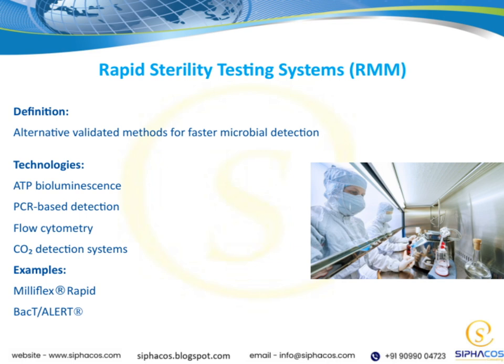As examples, systems like Milliflex Rapid and BACT/Alert are widely used in the industry. These tools help streamline testing processes, improve sensitivity, and reduce the time needed to ensure sterility. Overall, integrating RMM into our quality assurance programs aligns with our goal of faster, more reliable microbial detection, ultimately supporting better product safety and compliance.